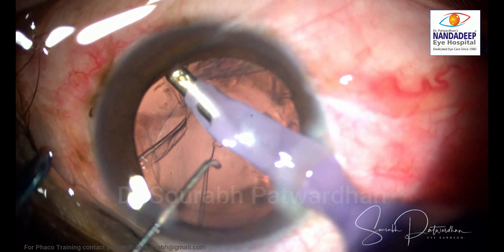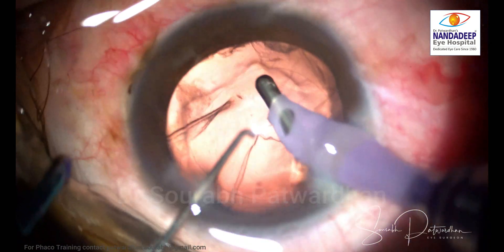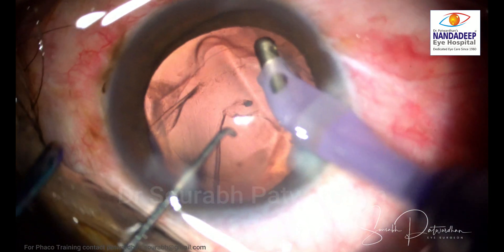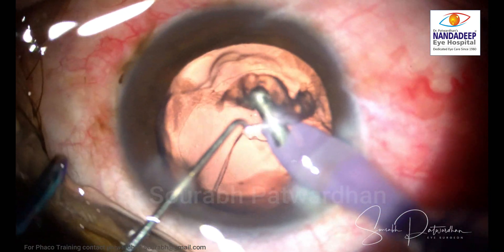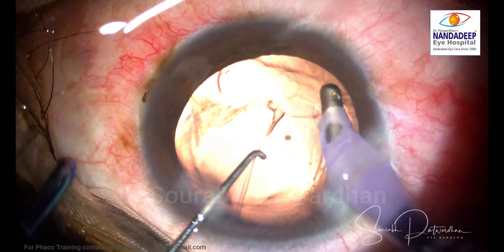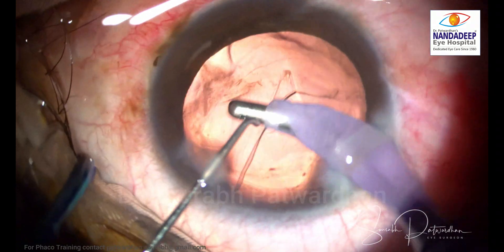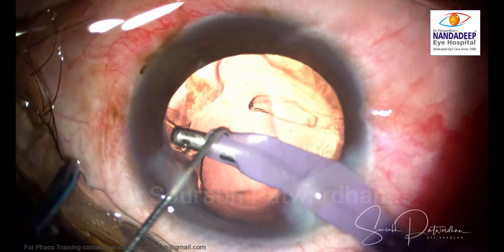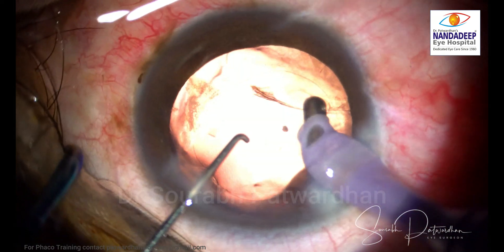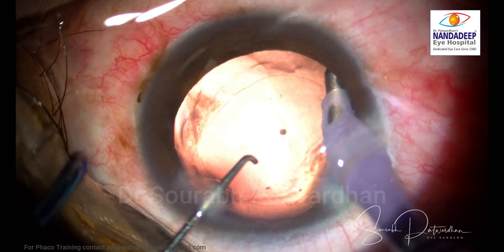In certain areas, if the anterior part of the cortex is cut, you can catch hold of the posterior cortical plate. Here you can see the anterior part of the cortex was being tried first, but if the anterior cortical part is partially cut, there is posterior cortex remaining. In such cases I catch hold of the posterior cortical plate and use lower vacuum to hold it and pull it out. So the anterior part of the cortex is cut and I am pulling out the posterior cortical plate. These are some tricks for removing cortex when the CTR is in place.